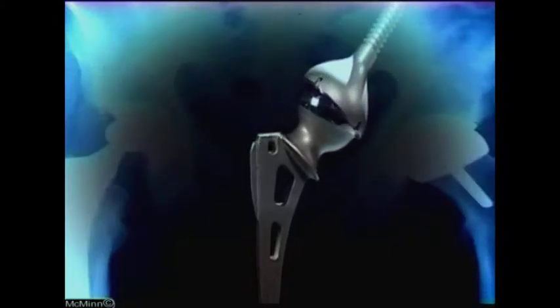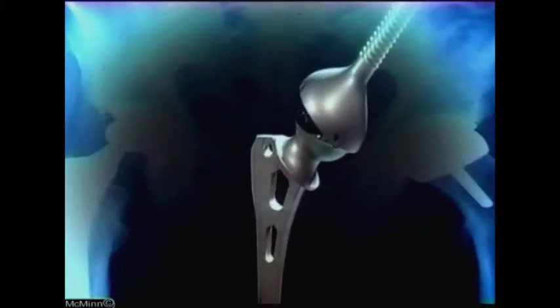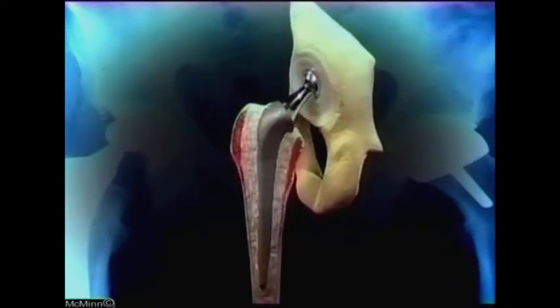Experiments in the early 60s found that metal-on-metal hip replacements were highly durable but were prone to friction, causing them to seize up or loosen, so they were abandoned in favour of metal-on-plastic joints, which are smoother and still in use today. However, metal-on-plastic joints have a limited life as the plastic eventually wears down. But when removed from patients, old all-metal joints, some over 25 years of age, were found to be in perfect condition. David McMinn turned detective.